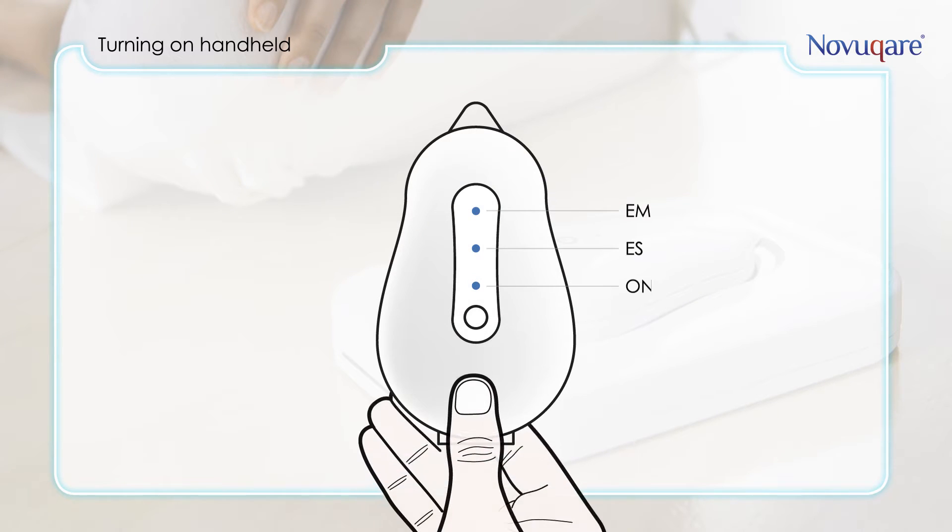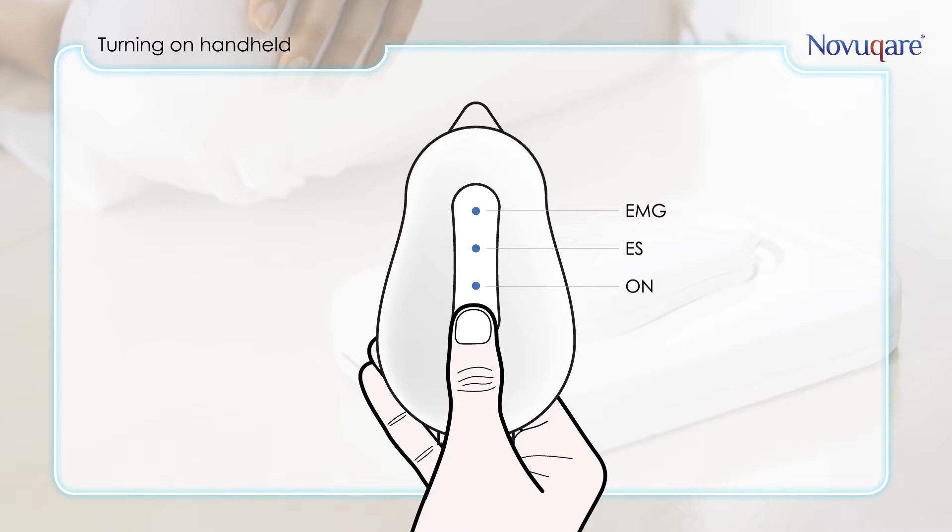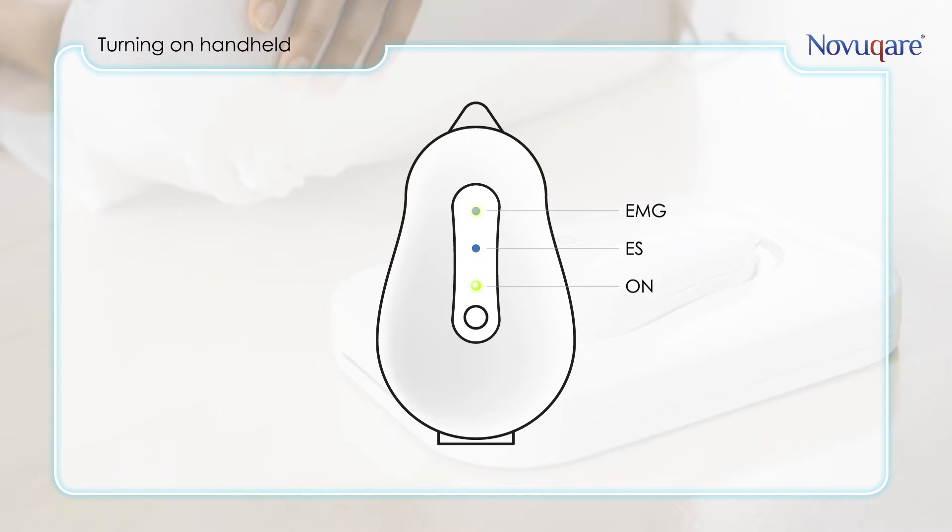To switch the handheld on, press down the on/off button until all three LEDs turn on. If the EMG LED is blinking, it means the handheld is searching for a Wi-Fi connection. If the EMG LED is off, the connection is established and the handheld is ready for use.